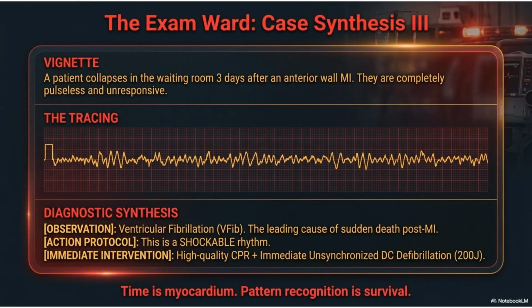Case 3. A sudden pulseless collapse post-MI is likely VFib. This is a shockable rhythm requiring immediate unsynchronized defibrillation.